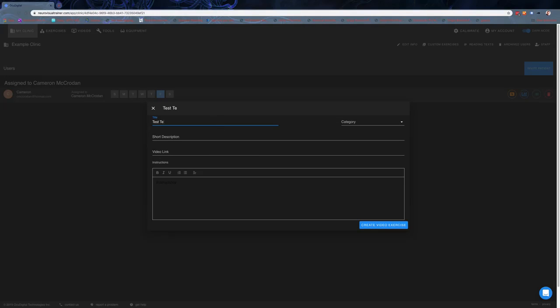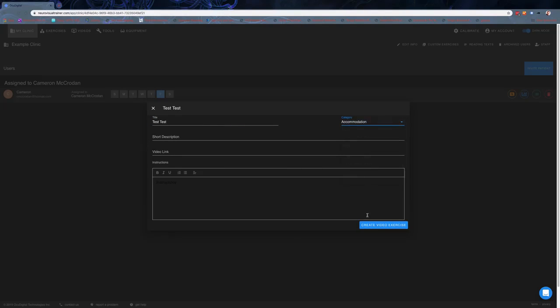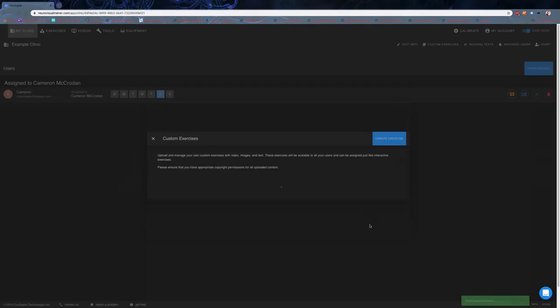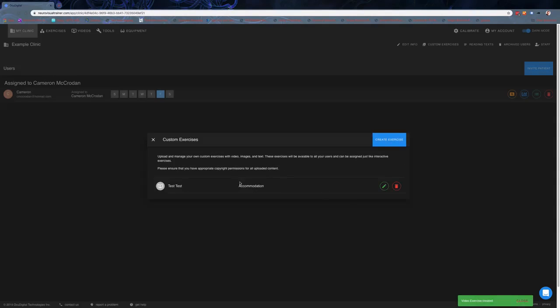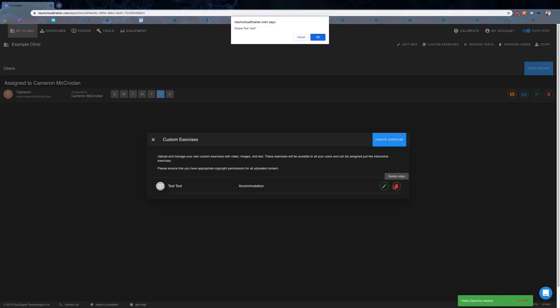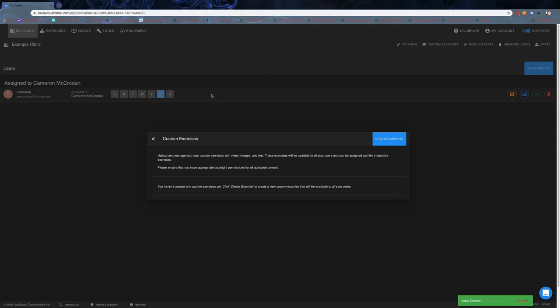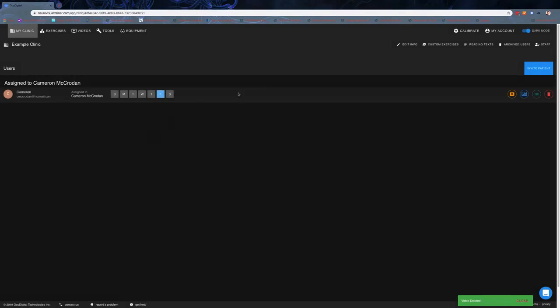If we come back through here, we click create, put in the title 'test test,' give it a category, and create the video exercise. It'll run through and put it into that category, which we can then get rid of.